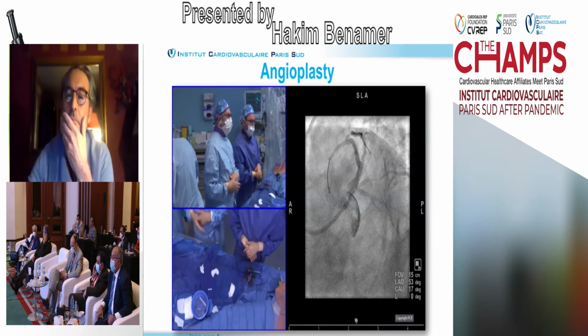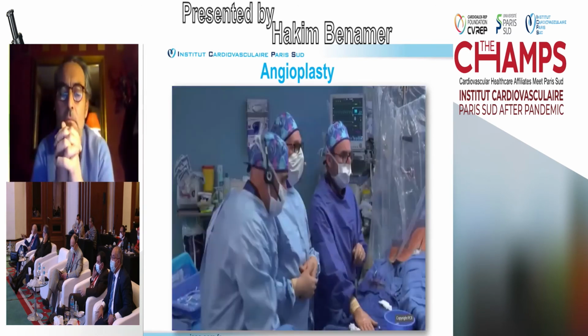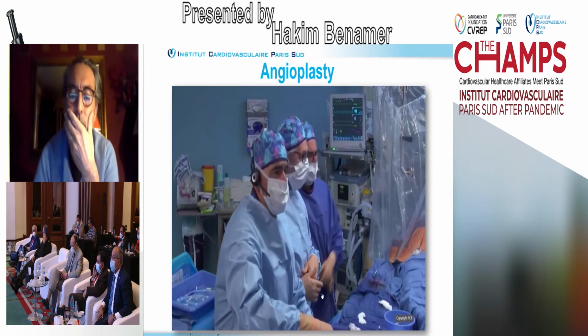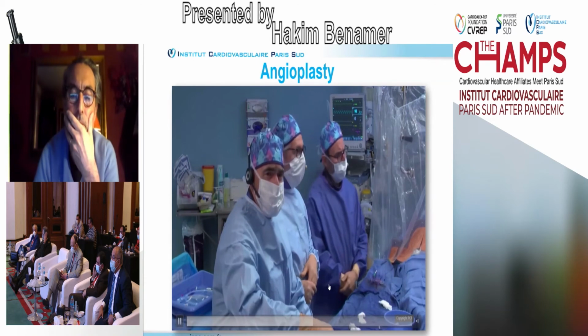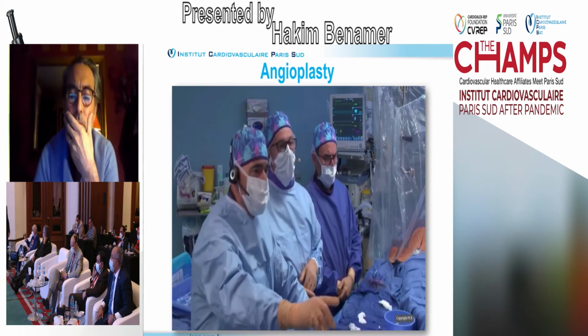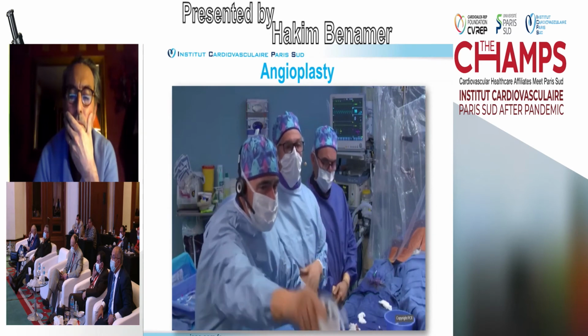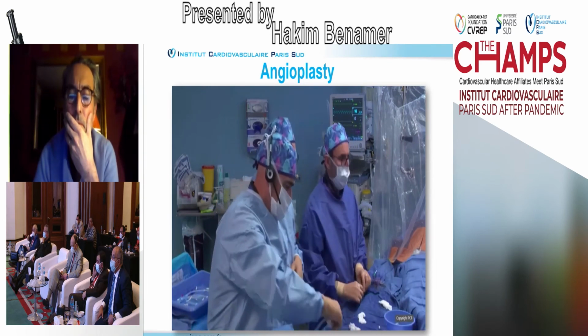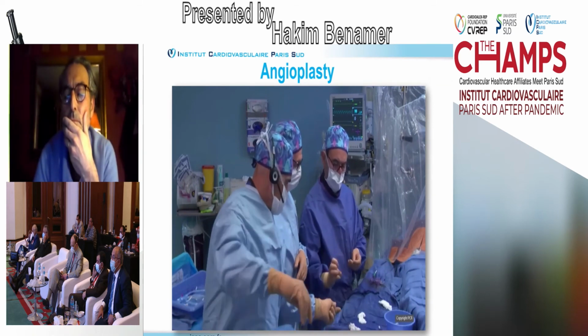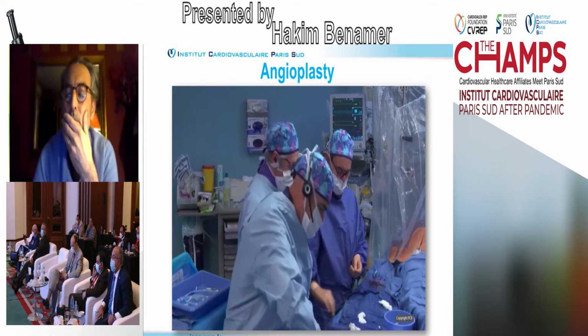I'm always afraid that there is no metal, and I think the risk of stenosis is really important. But I think we are waiting for several trials to confirm that. So we did some trials on bifurcation with this device.